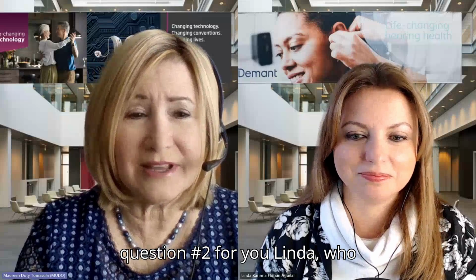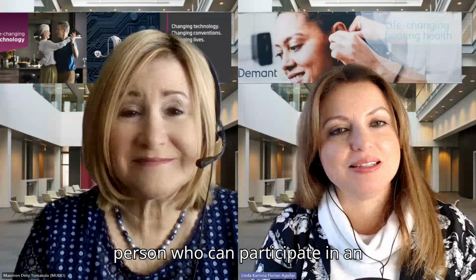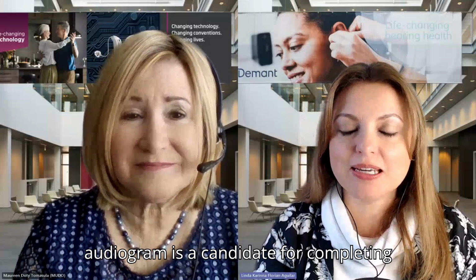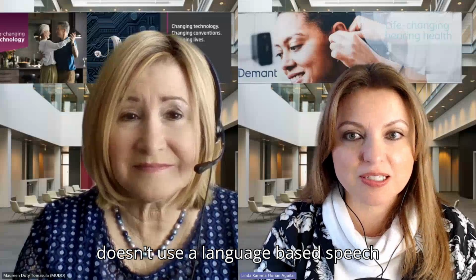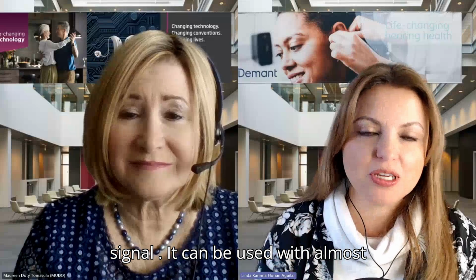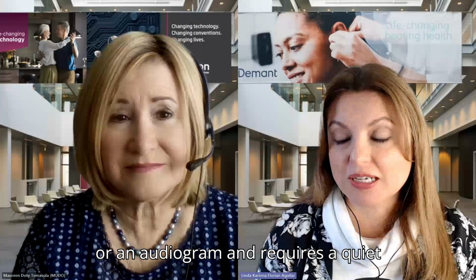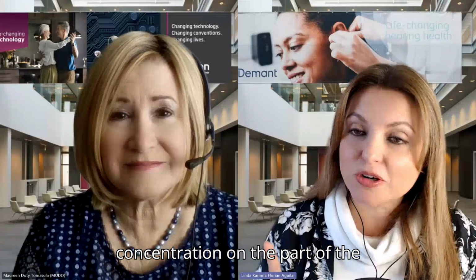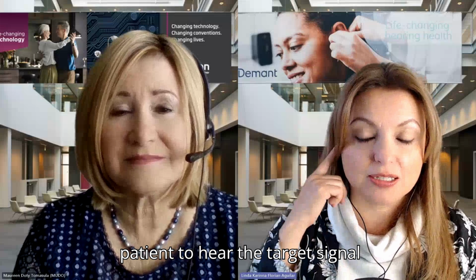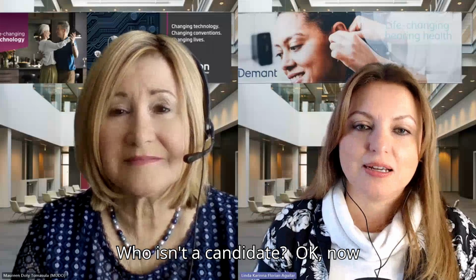Okay, question number 2 for you, Linda. Who is and who isn't a candidate for ACT? Okay, who is? Every person who can participate in an audiogram is a candidate for completing the ACT test because the test doesn't use a language-based speech signal. It can be used with almost any patient or client. The test is performed similarly to a threshold test or an audiogram and requires a quiet space. It does take a little more concentration on the part of the patient to hear the target signal compared to the background signal. Who isn't a candidate?